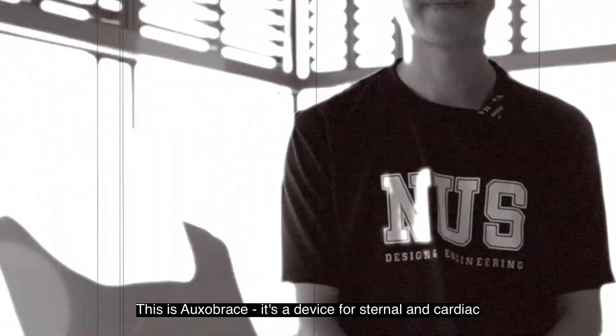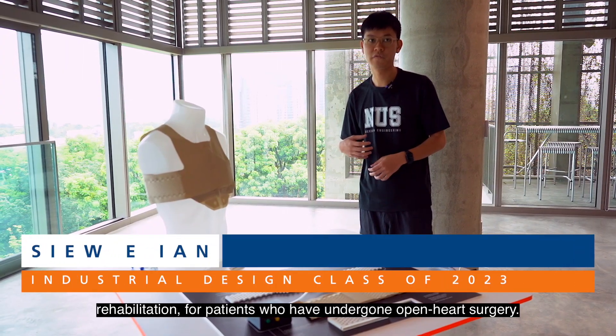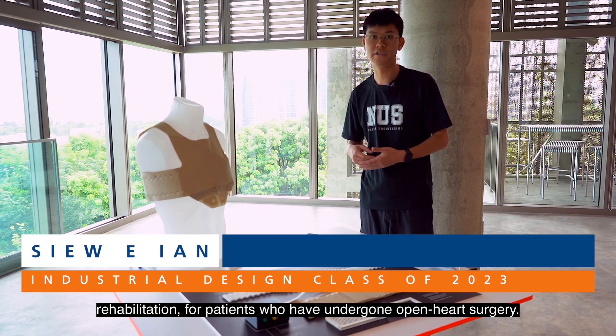This is Auxobrace. It's a device for sternum and cardiac rehabilitation for patients that have undergone open-heart surgery.